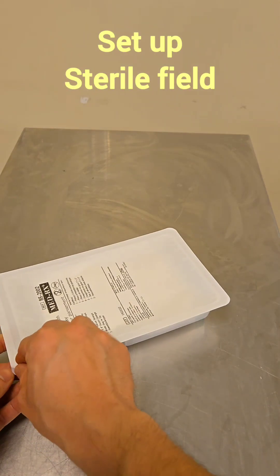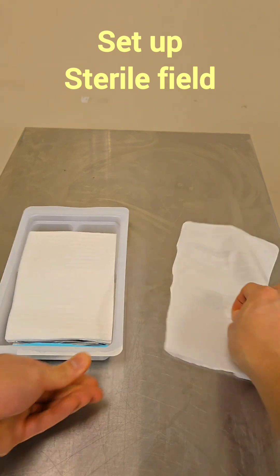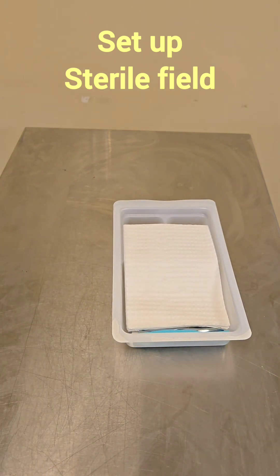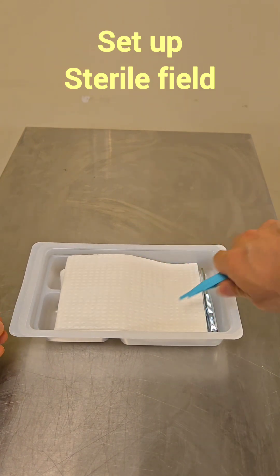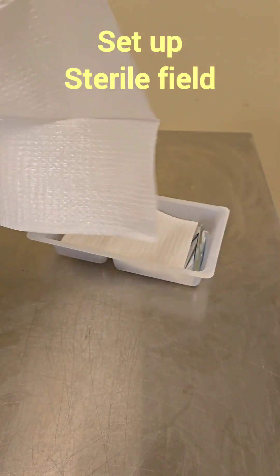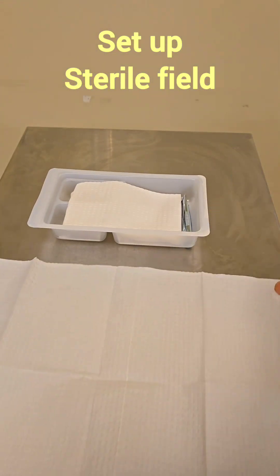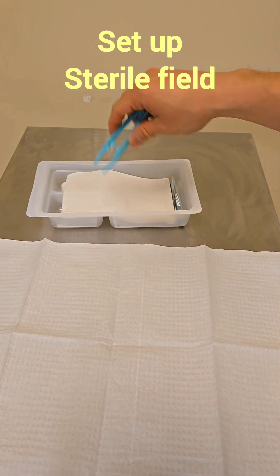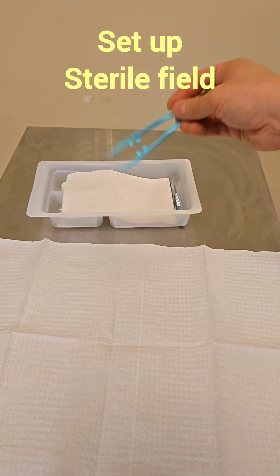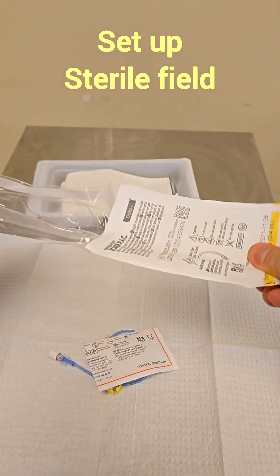As the chlorhexidine is drying, we're going to set up our sterile field. We'll start by opening our dressing tray. Remember, one inch around the border you can touch with your hands — that is considered non-sterile. We're going to put our gauze in there. Next we're going to drop everything into our sterile field — the needle, open it up and drop it in.